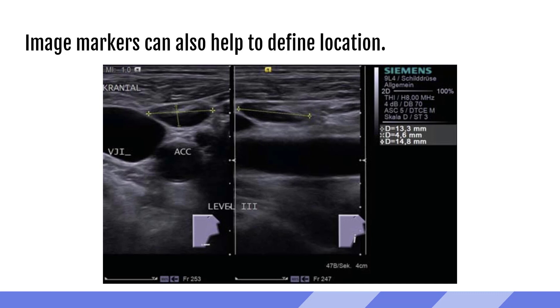Using the levels is a more precise way to describe where you are seeing lymph nodes, but you also have the option to use image markers on your screen, which can also aid — especially if you're not 100% sure what level you're in, you can mark it on the neck for whoever's reading. Here we have an example of the transverse and longitudinal view of a lymph node at level 3 — right in the middle of the neck, a little bit more in front of the sternocleidomastoid — giving the reading provider an exact idea of where this lymph node was located.